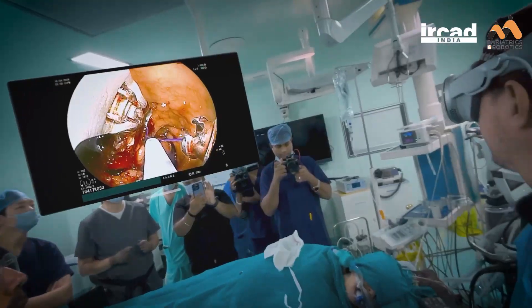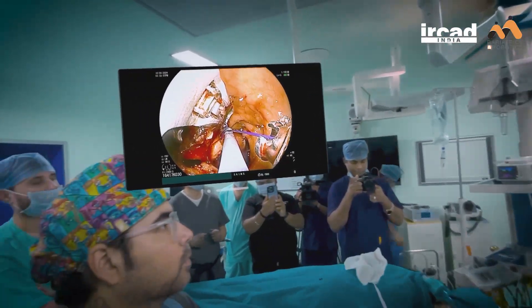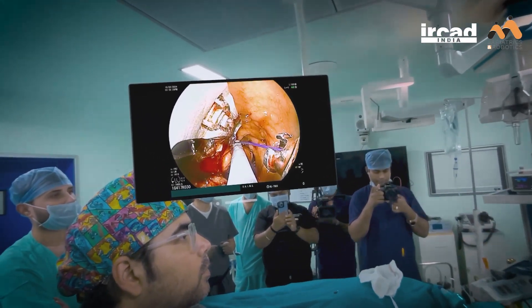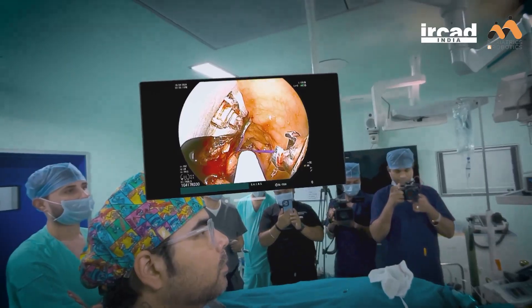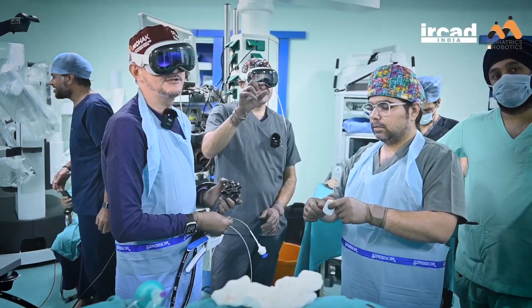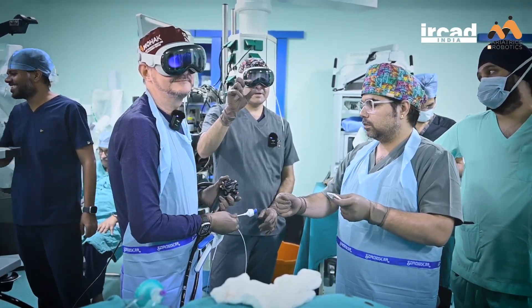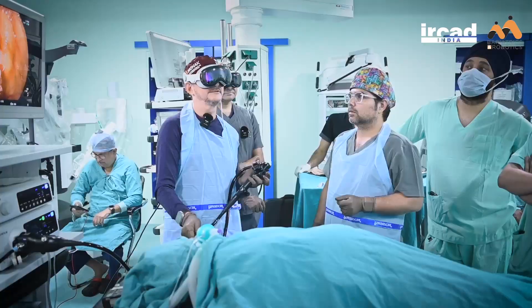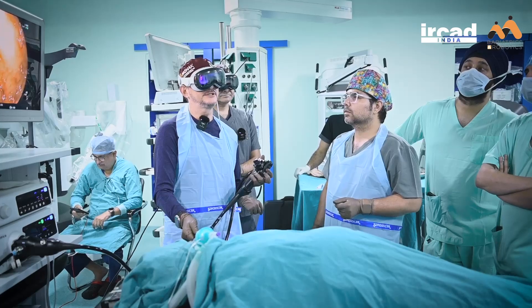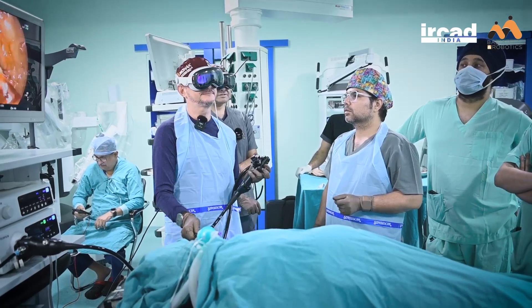Very precise movements like that, which you can do. I'll stop my recording. How do you like that, Mohit? Very nice.